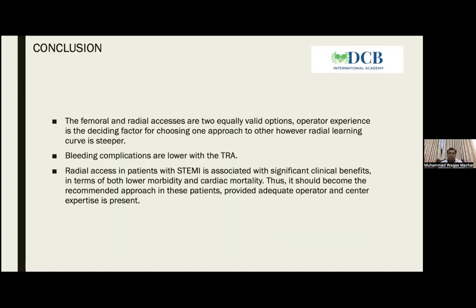So in conclusion, the femoral and radial accesses are two equally valid options. Operator experience is the deciding factor for choosing one approach over the other. However, radial learning curve is steeper. Bleeding complications are lower with the transradial access.